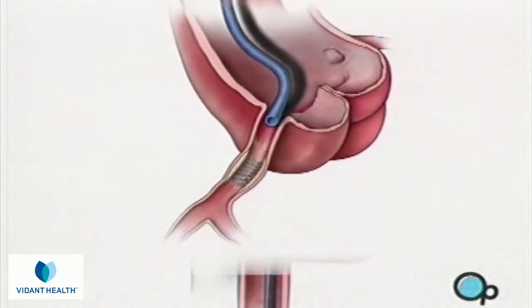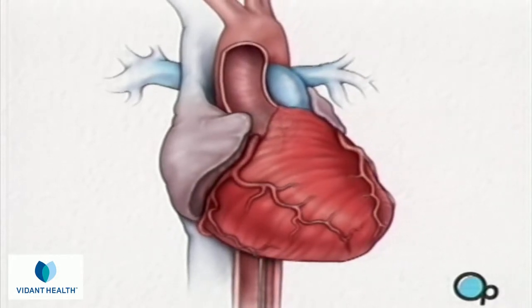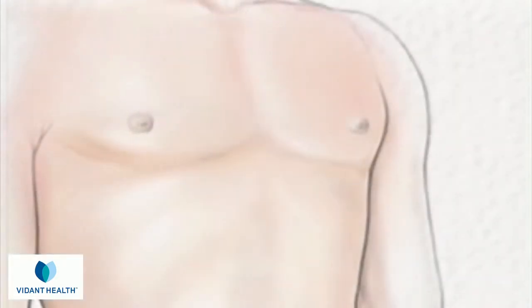The dye that had been injected will break up and leave your body as waste. Slight pressure is applied to the incision in your leg in order to prevent bleeding.